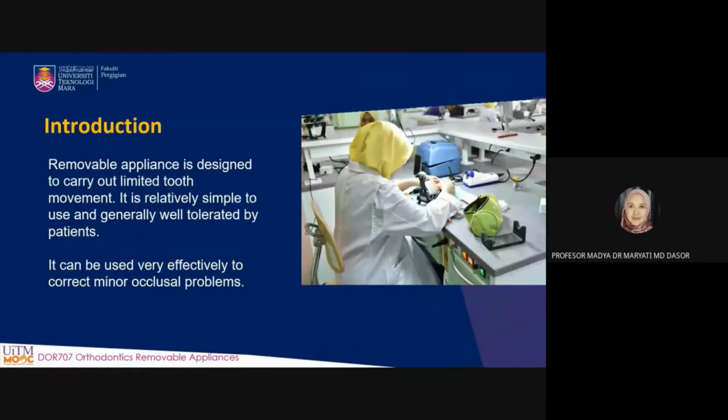Removable appliance is designed to carry out limited tooth movement. It is relatively simple to use and generally well tolerated by patients. It can be used very effectively to correct minor occlusal problems.